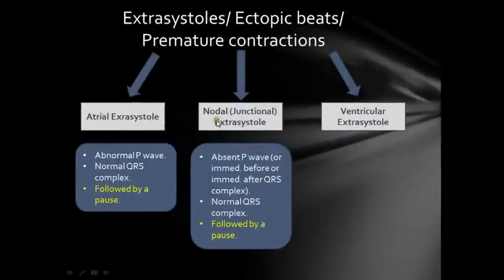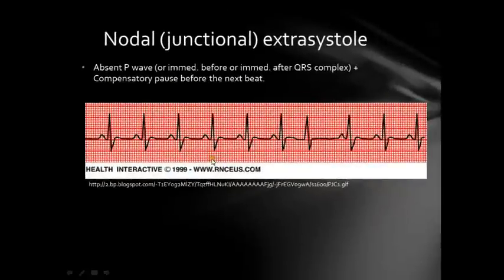The second type is called nodal or junctional extrasystole, and it's exactly the same as atrial extrasystole. The only difference is that the P wave is absent — it could be immediately before or immediately after the QRS complex, but it's usually absent. The QRS is normal and it's followed by a pause. Looking at this example, the rhythm is irregular at one point. The P wave is absent, the QRS is normal — less than three small squares — followed by a pause. This is nodal or junctional extrasystole, originating from the AV node.